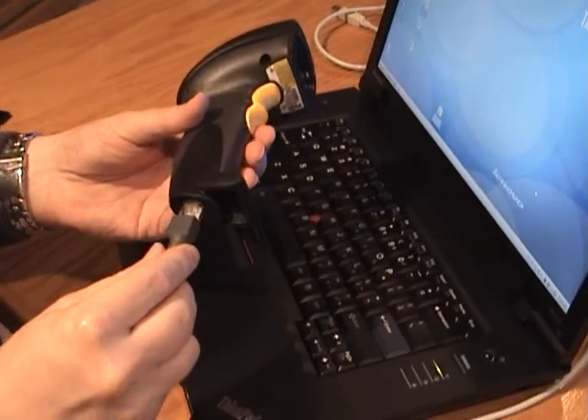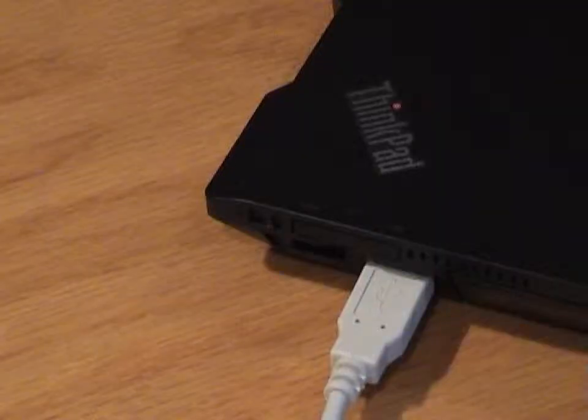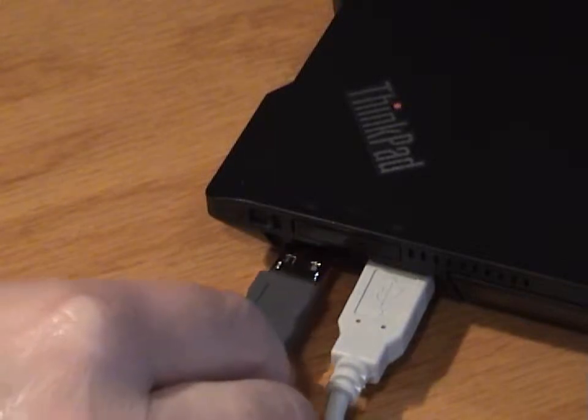If the hand scanner cable is separated, you will need to plug the phone-style connector into the bottom of the scanner. Plug the scanner's USB connector into any available USB port on the laptop.